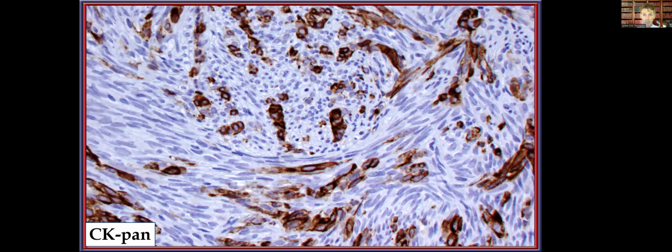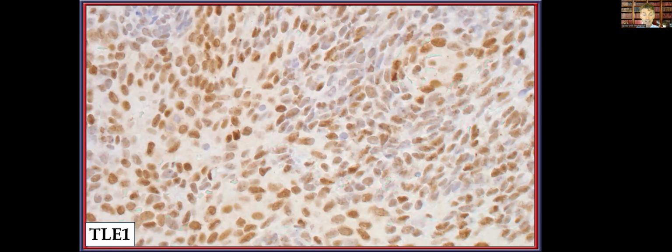This is an example of that biphasic tumor I just demonstrated, where you can see that the epithelioid cells, as well as several of the spindle cells, are reactive with CK-pan. But in this example, there's a very strong TLE1 that is easily identified in the nucleus of these neoplastic cells. You should make sure that you're using the best clone available, otherwise you may have spurious reactivity.